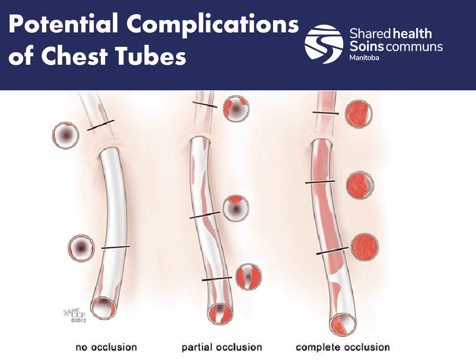So some issues that may come across when dealing with chest tubes. If we have drainage that stops within the first 24 hours after chest tube insertion, it may be clogged by a clot or by a fluid blockage in a dependent loop. Again, we don't want our tubes looping over because that gives the blood some place to sit, and that can clot up and cause blockage. So we want to make sure our tubing is flat or at least straight.